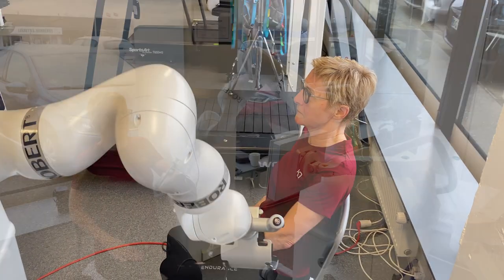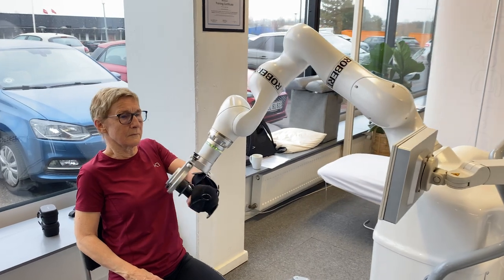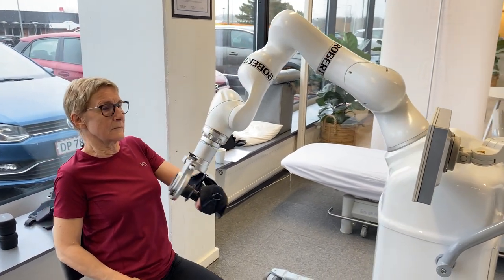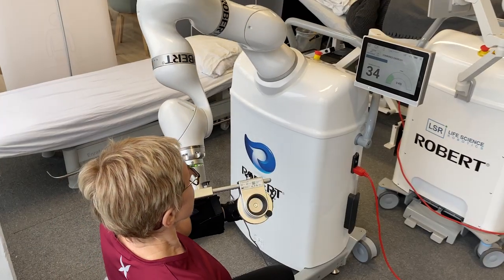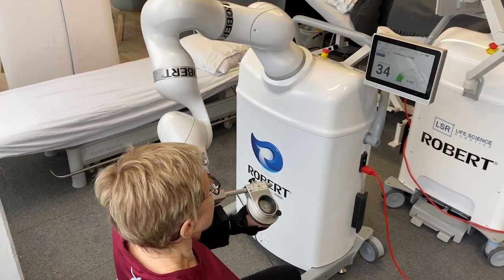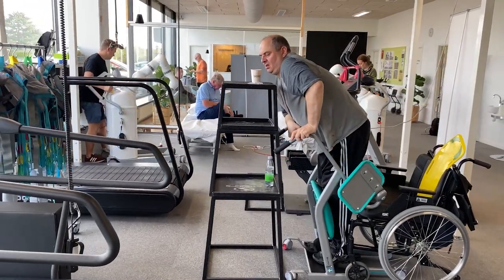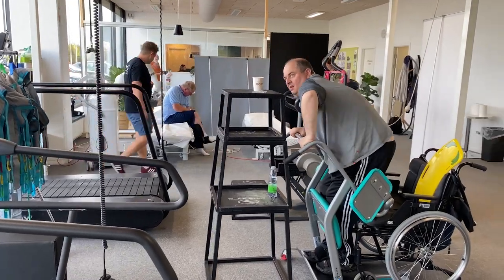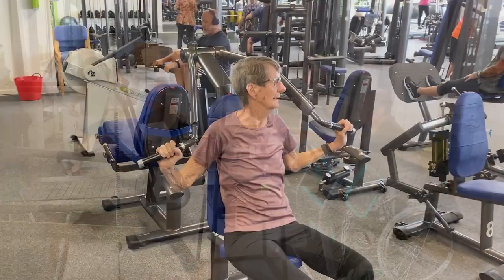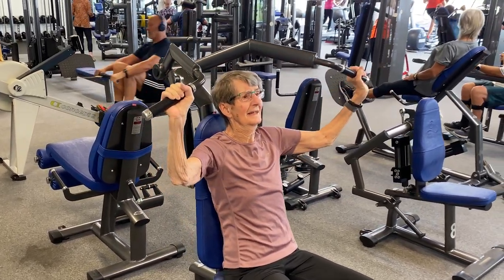It's really a win-win situation for us because we get to have more patients with less workload, and the patient gets a whole lot more rehabilitation. We have it set up so they have a one-hour normal neurological rehabilitation session, and then if they choose to go in the robot they have another hour of robot training — either one hour before or one hour after normal training. So it's two hours, maybe two or three times a week.